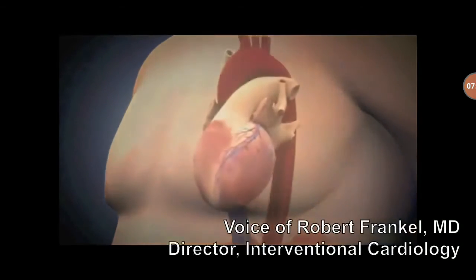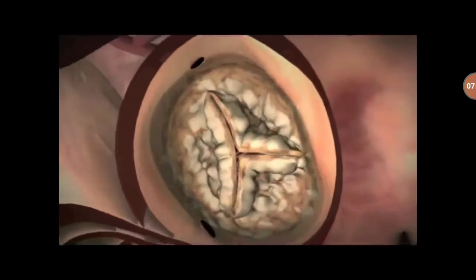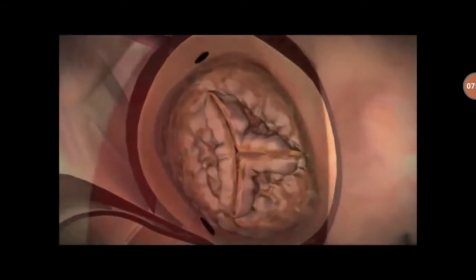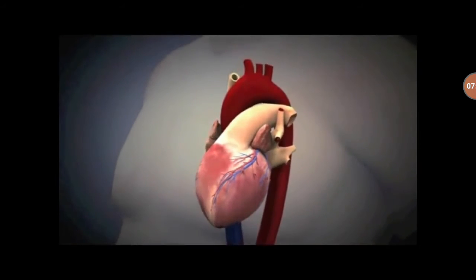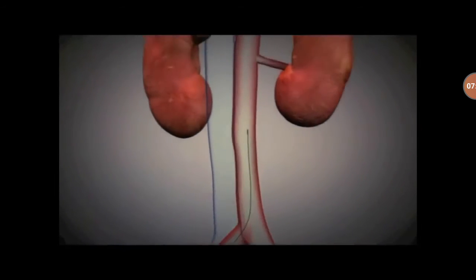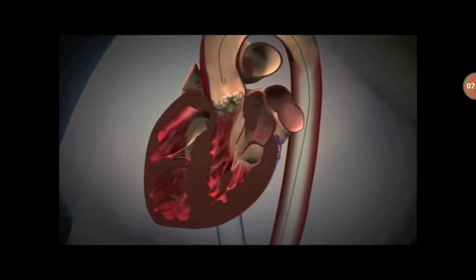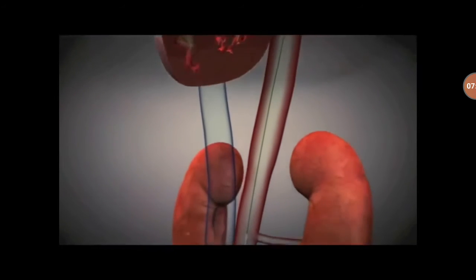The transcatheter aortic valve replacement procedure is performed on patients who have severe calcified aortic stenosis. And here you see an aortic valve that's not opening well. It's severely calcified and the leaflet motion is restricted. So to perform the TAVR or transcatheter procedure, a wire is inserted in the femoral artery. It is threaded up through the aorta and around the aortic arch. And then that wire is passed through the stenotic aortic valve and placed in the left ventricle.